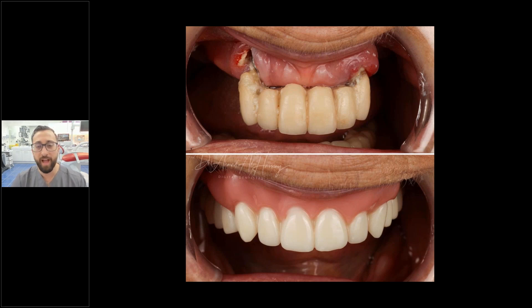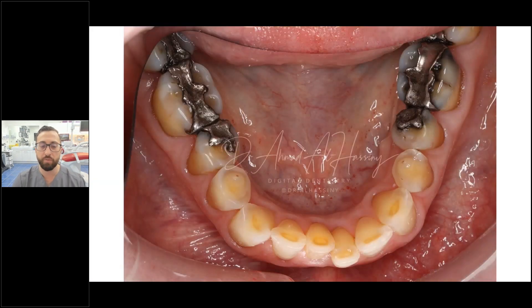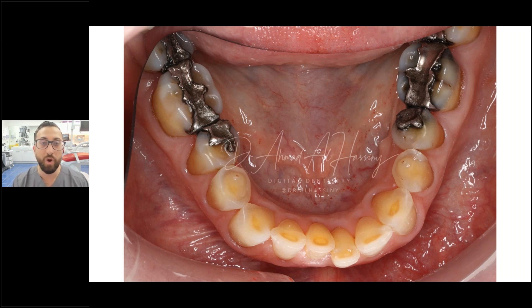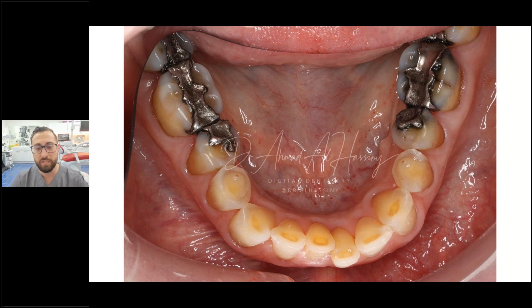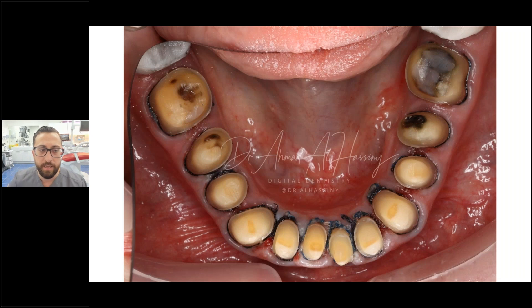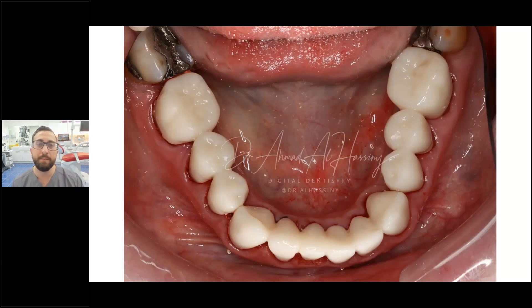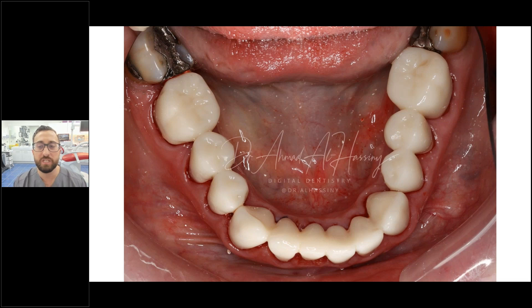Printing crowns and temporary restorations is another area. There's a lot of talk about whether permanent printed resin crowns will live up to the hype — I still think a resin is a resin and it's hard to beat zirconia or lithium disilicate, but they have their place. This full-mouth rehab case I carried out a few months ago shows how you prep, scan, and print the restorations — in my mind these are infinitely better than any direct temporary like Protemp or LuxaTemp.